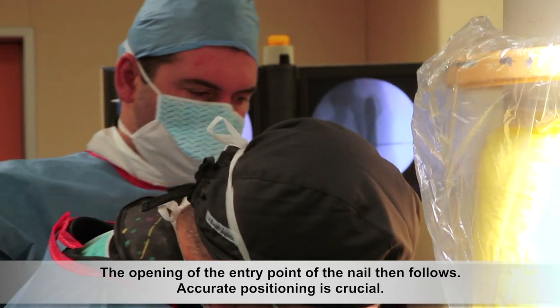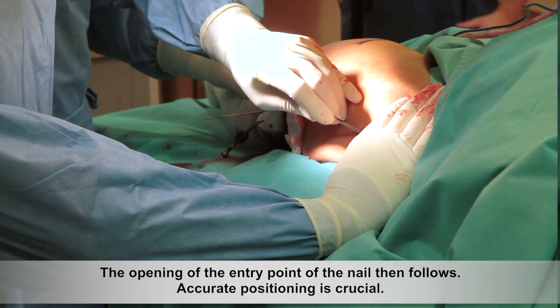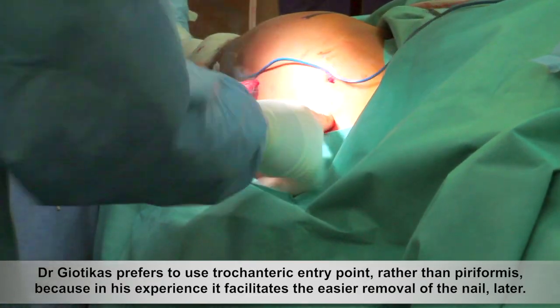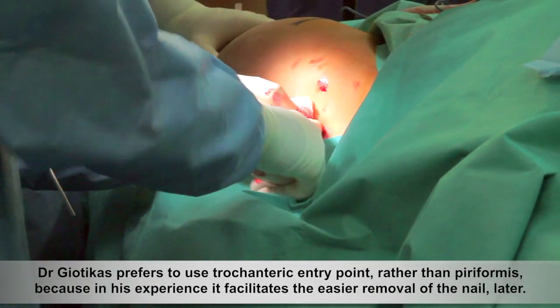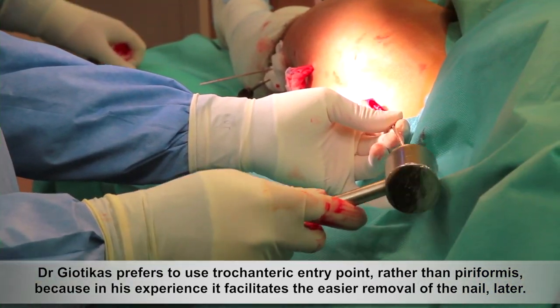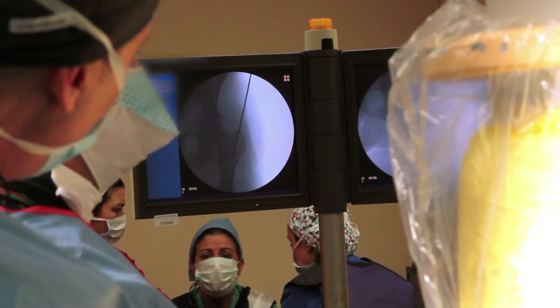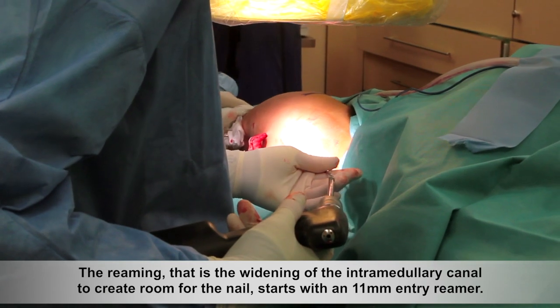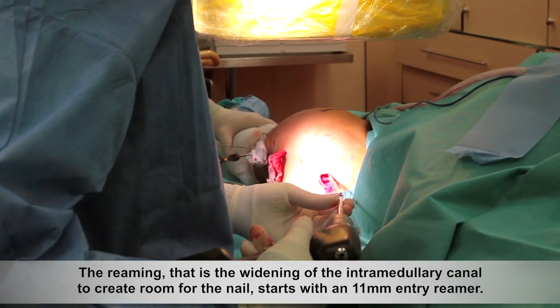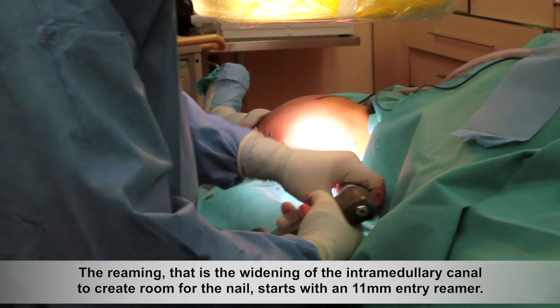The opening of the entry point of the nail then follows. Accurate positioning is crucial. Dr. Geotekas prefers to use the trochanteric entry point rather than piriformis because, in his experience, it facilitates the easier removal of the nail later. The reaming — that is the widening of the intramedullary canal to create room for the nail — starts with an 11 mm entry reamer.